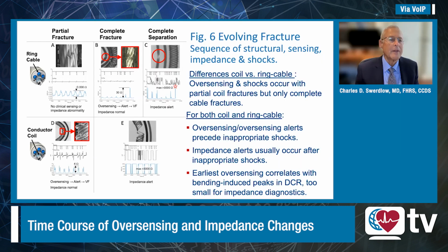Yes. This slide shows figure 6 in our manuscript, which summarizes the sequence of structural changes, sensing electrogram changes, impedance changes, and development of inappropriate shocks as fractures develop for both the cable conductor that goes to the ring electrode and the helical coil that goes to the tip electrode.